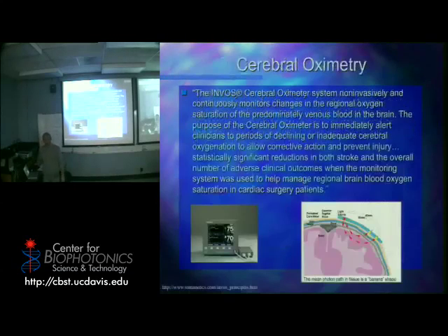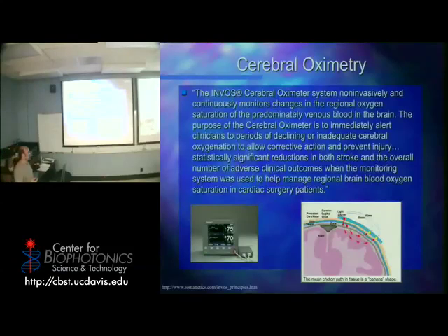One of the last things I want to show you about pulse oximetry is that just as I can figure out how much oxygen is in your finger, your ear or through your eye, I can do the same thing to see whether oxygen is flowing in parts of your brain. This is a cutaway of a skull, a drawing. Here's the skin, the bone, and the brain.